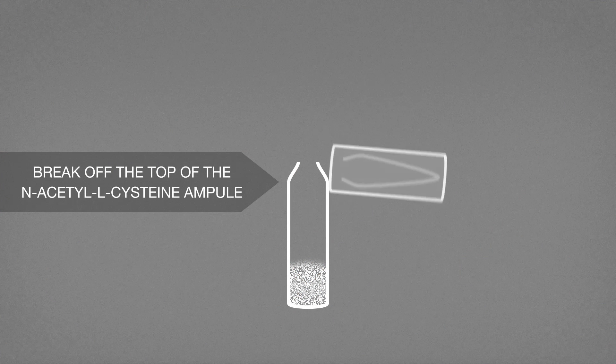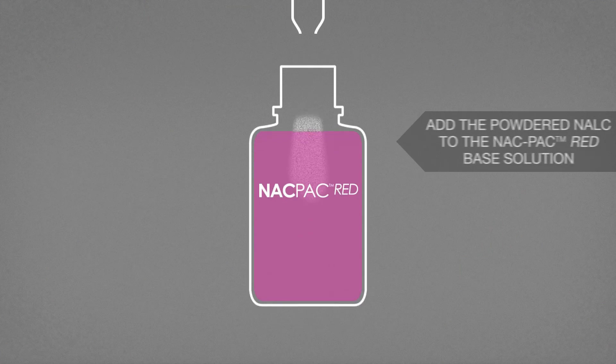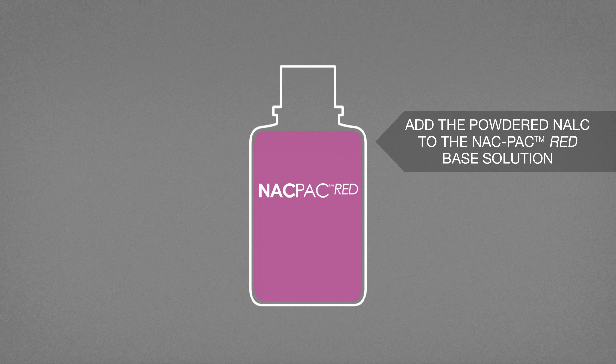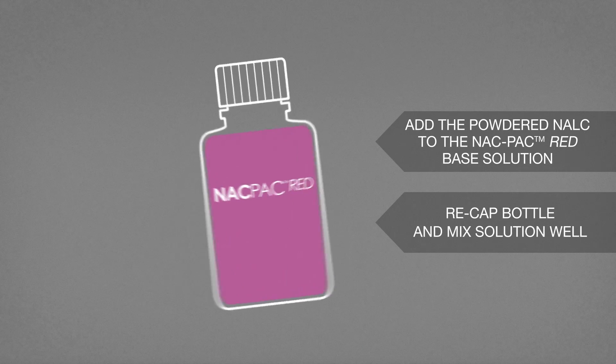Break off the top of the N-Acetyl-L-Cysteine ampule. Add the powdered NALC to the SnackPak Red base solution. Recap and mix the solution well.